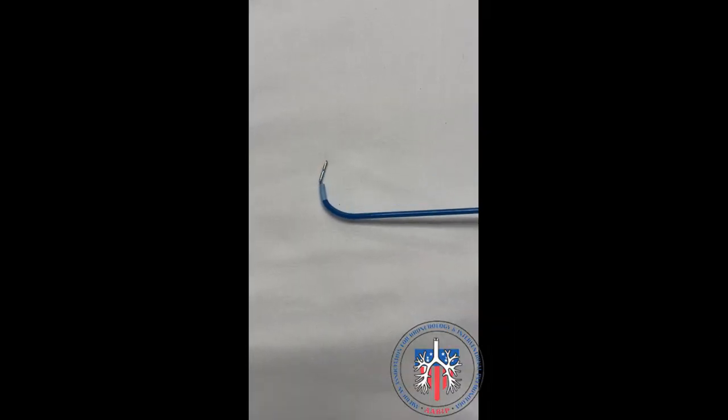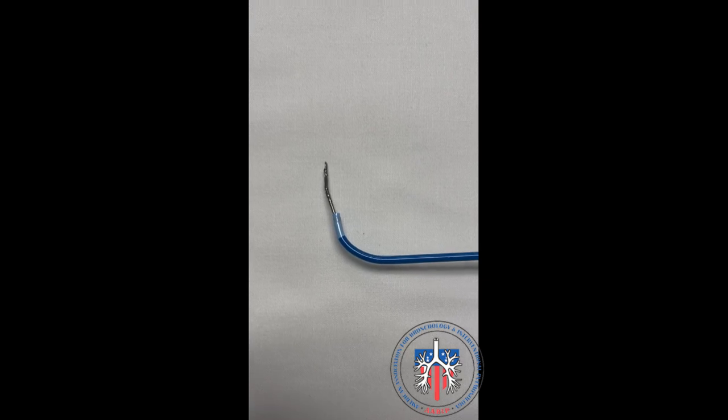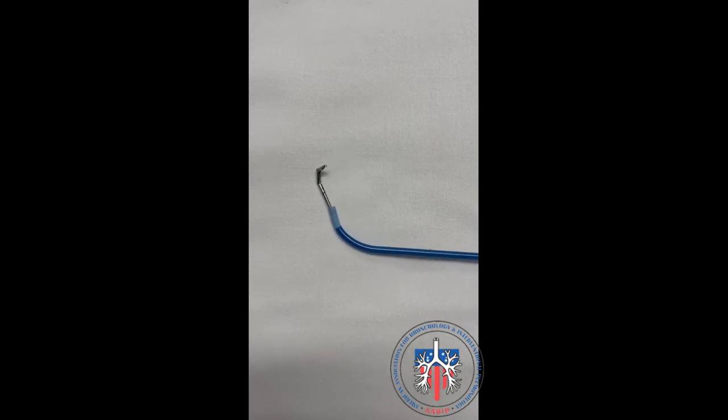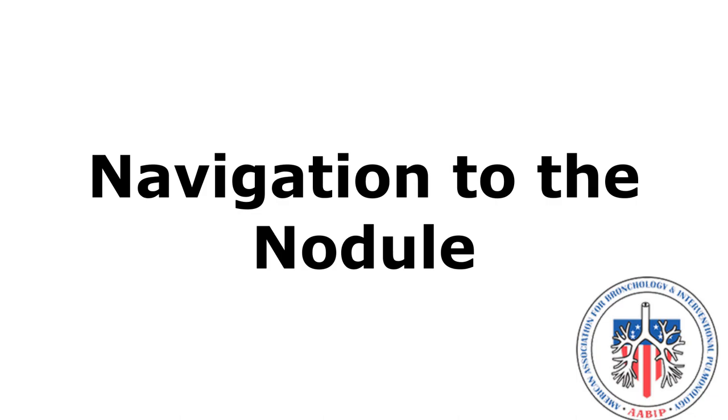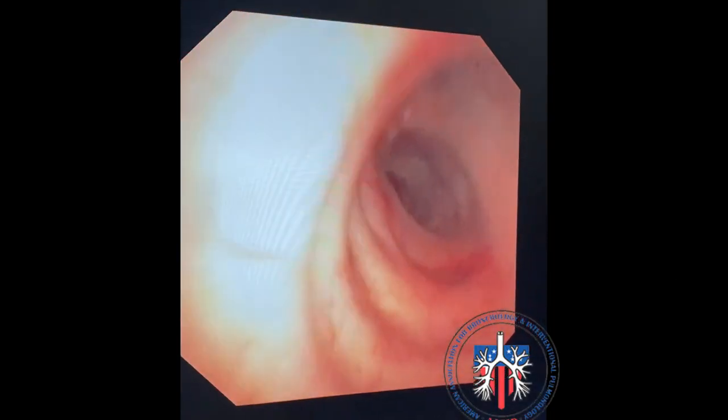This example does not use the Olympus guide sheet; instead, a 90-degree SuperDimension Edge catheter is used. The guiding device is advanced through the sheath, flexed and turned in the desired direction. The guide sheet is then advanced over the guiding device into the desired airway. In this next example, a guide sheath and guiding device are not used.